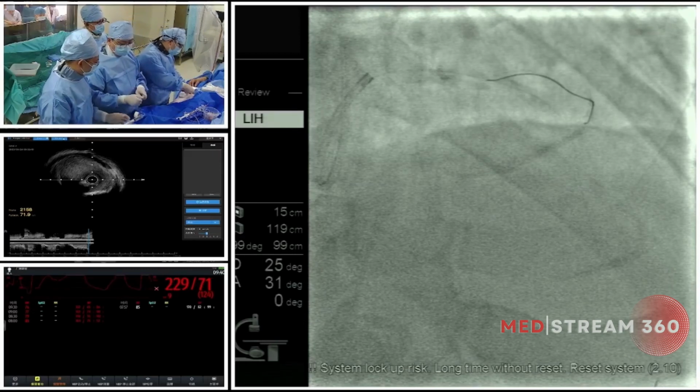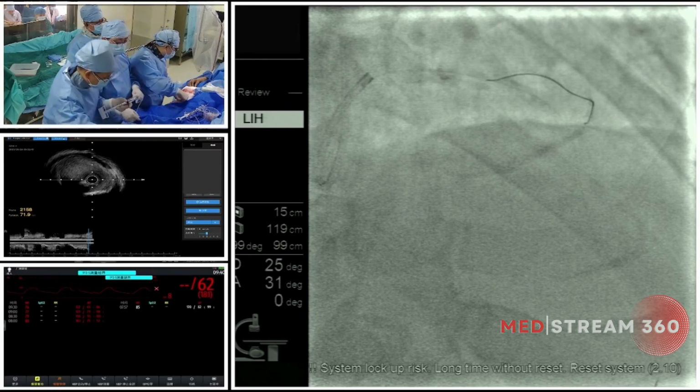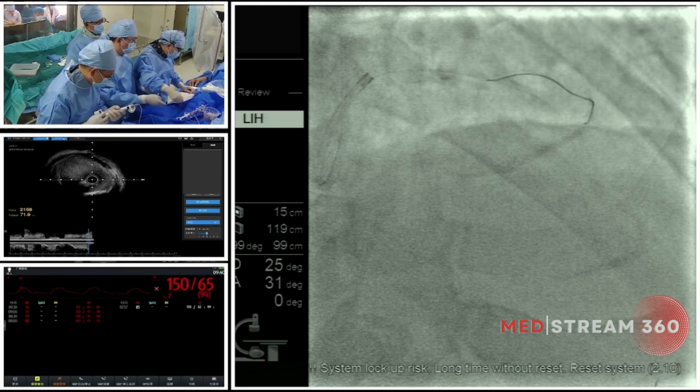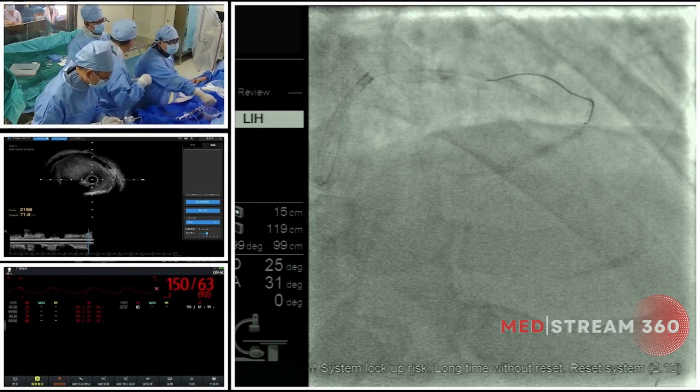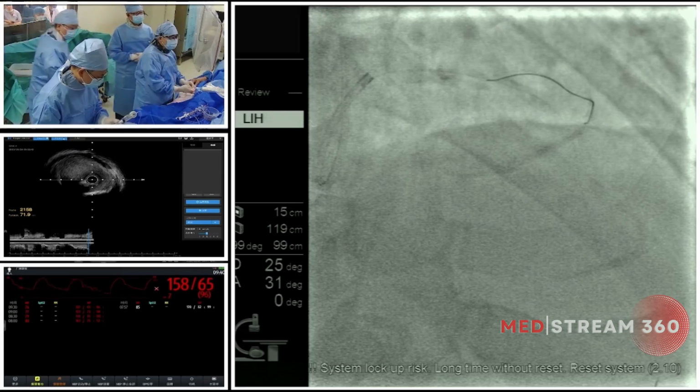For the stenting, because the lesion is diffuse, there's no good spot to land the stent at the proximal LAD. That's why you want to cross the circumflex, right? Two stents, yeah, and the second stent has to cross the circumflex.